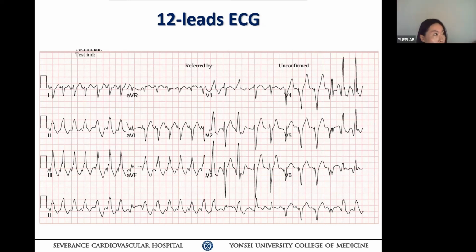Atypical, one of R. Well, you have a small notching in the upstroke, right? The second rabbit ear is taller. So what does that mean? V2 has a taller R and a smaller second notch. But the V1, you cannot exclude the possibility this could be aberrancy, maybe.